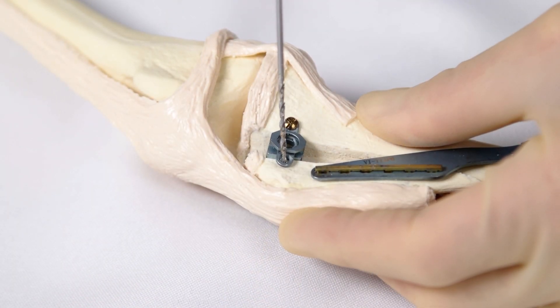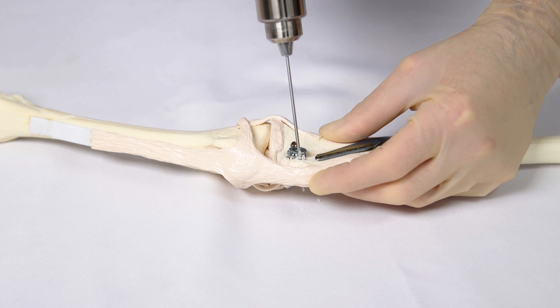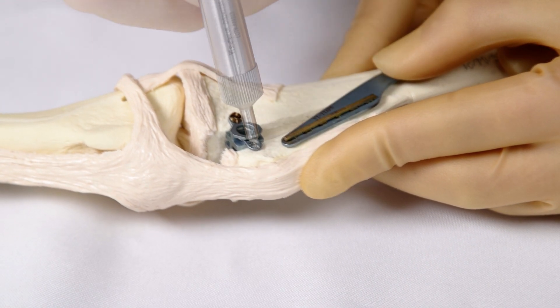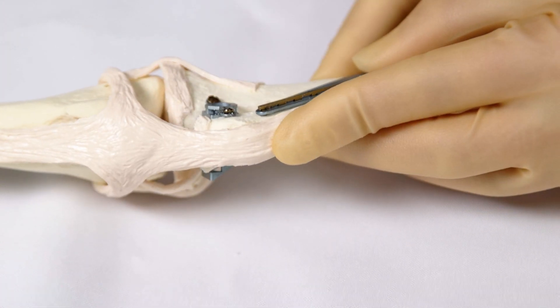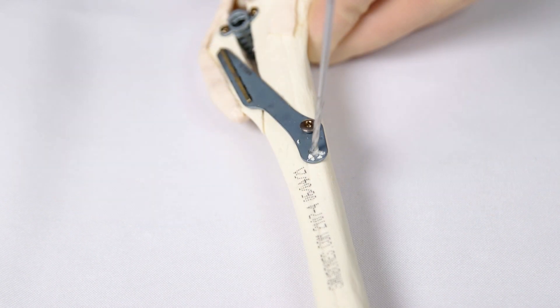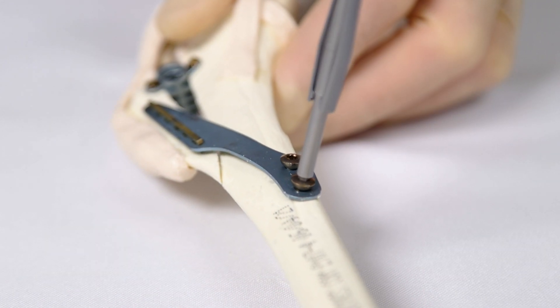Now drill the pilot hole for the cranial cage screw using a 1.8 millimetre drill bit. Aim for where there is most bone stock, usually slightly cranial and slightly distal. Measure the depth of the pilot hole and place a 2.4 millimetre titanium screw of the appropriate length. Ensure that this screw is not over long. Finally, the second distal plate screw is placed — a 2.7 millimetre or 3.5 millimetre screw, as appropriate.